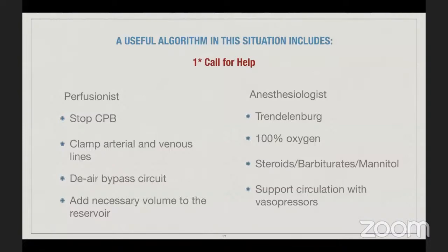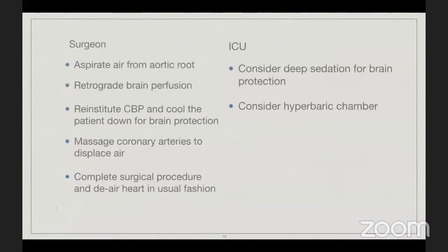And upon weaning, the anesthetist may give the patient barbiturate and mannitol and deep anesthesia for 2 days in the ICU. And for post-operative management, you go to post-operative management now after you connected the cannula to the SVC for retrograde perfusion to the brain and for flushing.